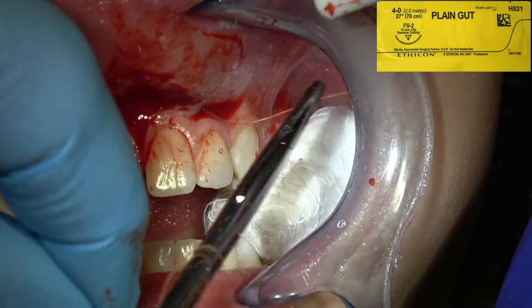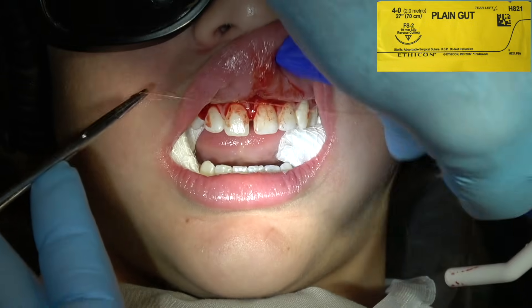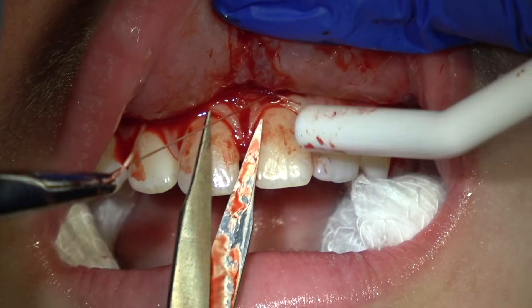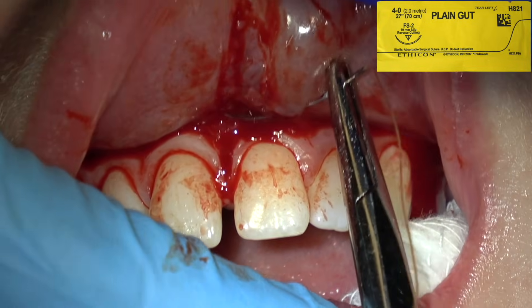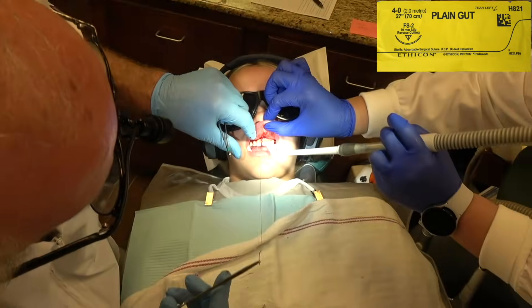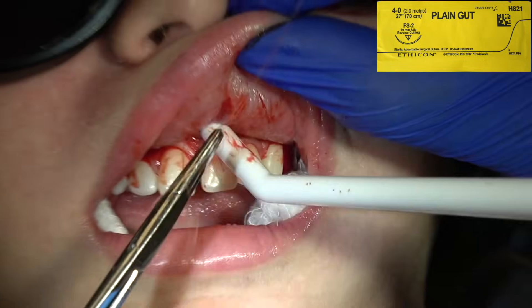Many times I'll do three wraps on the first pull just because it keeps the suture from unraveling when you're pulling it. If it's 3-O, sometimes just one, two will work, but with 4-O I like to go one, two, three — then one toward me, then one away. You can pull the parts together in the unattached to unkeratinized gingiva and actually connect the flap. You want the knot to be aligned properly — not bunched up. Pull it so that the knot is flat. That's a good snug knot. Leave about two millimeters of length when you cut. You don't want to cut it right at the knot or it will untie.